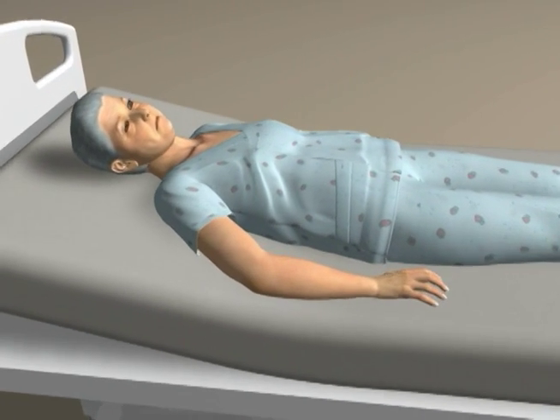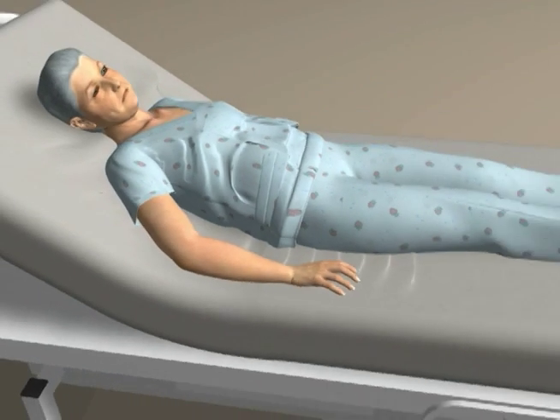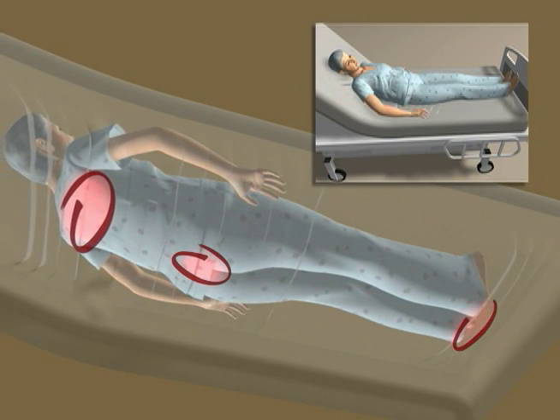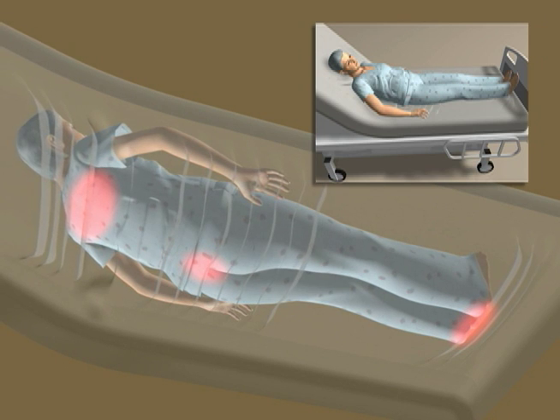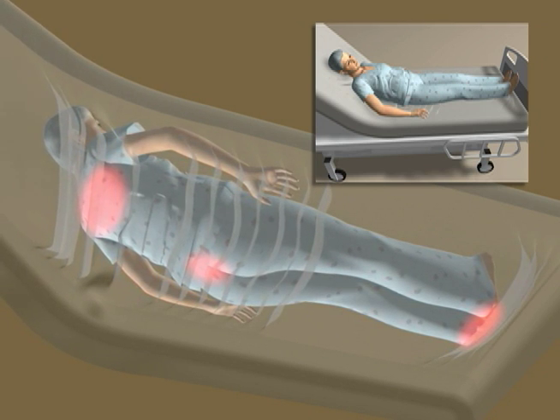Without effective shear reducing intervention, the skin and deep tissues are vulnerable to shear-induced trauma at the scapula, sacrum, and heels. This is intensified when the head of the bed is elevated, pushing the user toward the foot of the bed.